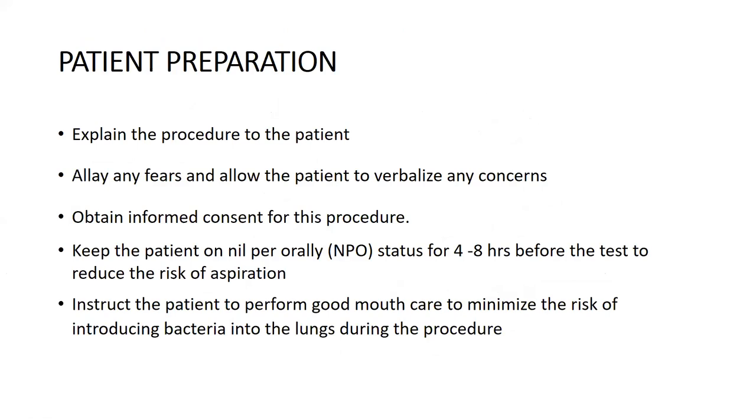Before performing the procedure, preparation of the patient is very important. We have to explain the procedure to the patient so that the patient feels comfortable and gets ready for the procedure without any fear. Before the procedure, we have to take informed consent, and the patient should be kept nil orally for 4 to 8 hours before the procedure to reduce the risk of aspiration. The patient should also be instructed to maintain good oral hygiene to minimize the risk of introducing bacteria into the lungs during the procedure.